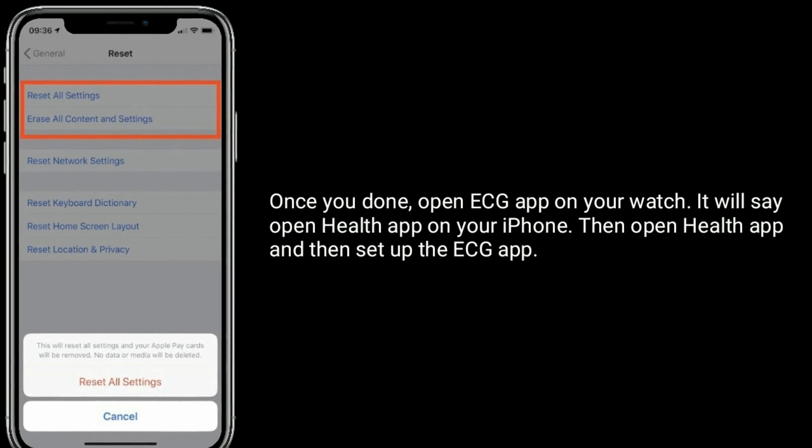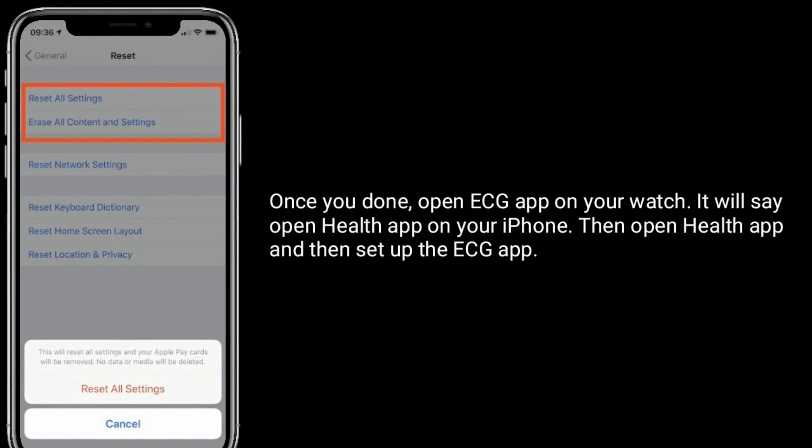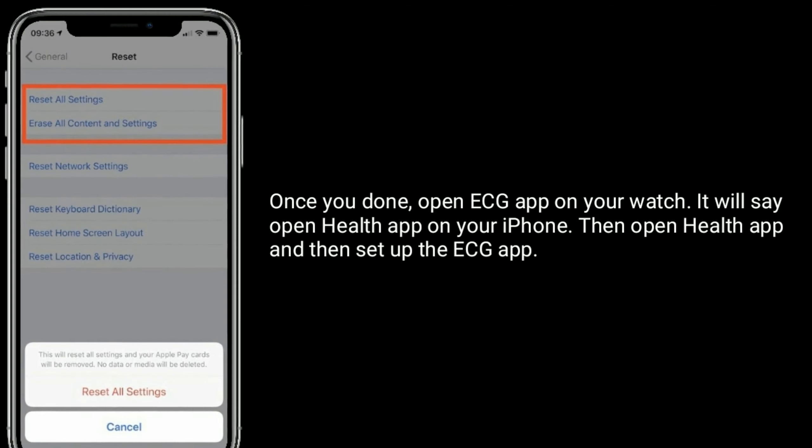Once done, open the ECG app on your watch. It will say open Health app on your iPhone — then open the Health app and set up the ECG app.